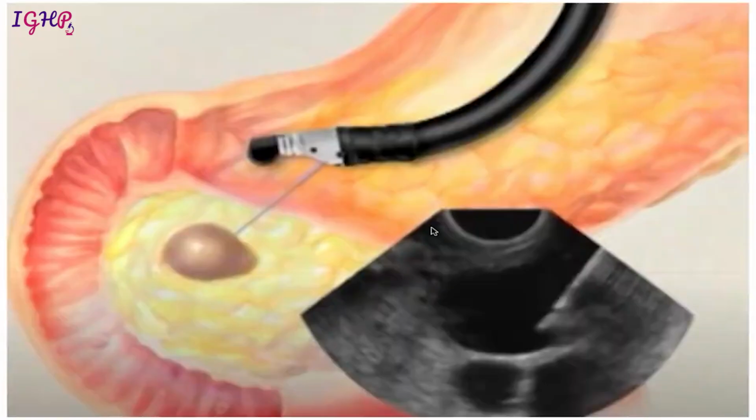So we should be aware of this when we are going for an on-site evaluation of an endoscopic ultrasound guided FNA. Now, as I said previously, this is an endoscope, and at the top of the endoscope we have the probe through which we can visualize the lesion. When they open the ultrasonographic probe, they could visualize that if this is a pancreas, there is a lesion in the pancreas, and once they have identified the lesion in the pancreas with the help of ultrasound, they can pull out the needle and start to sample the pancreatic lesion. So this is an ultrasonographic representation of the same, showing that the lesion in the pancreas is sampled with the help of the needle.